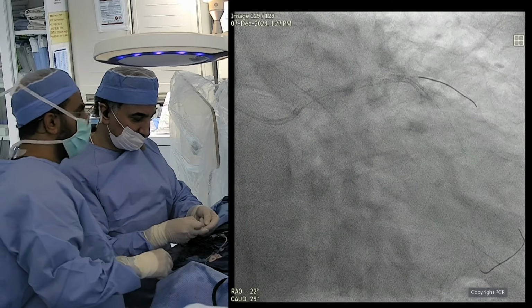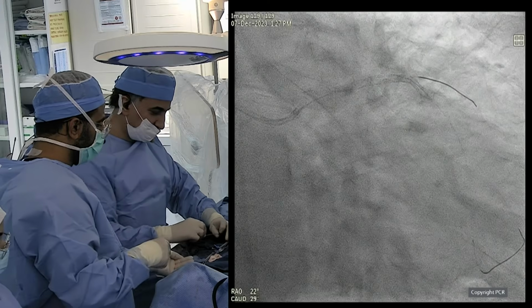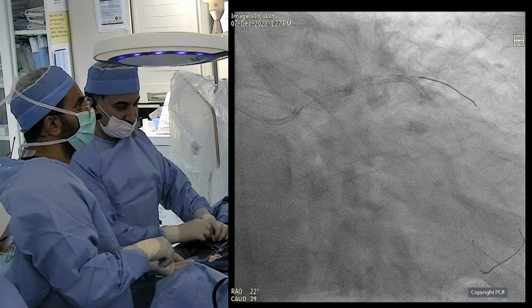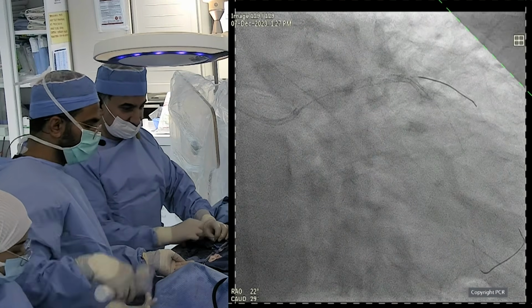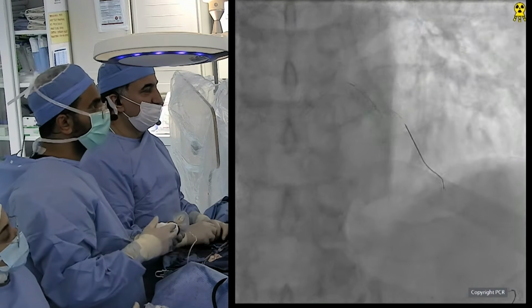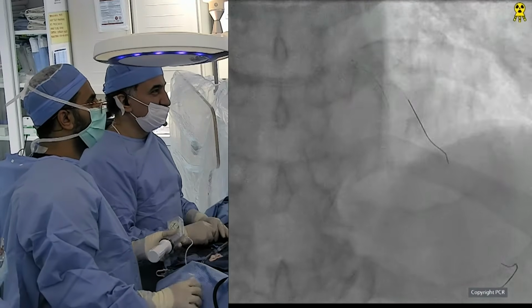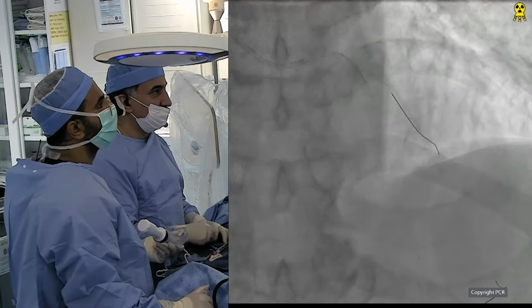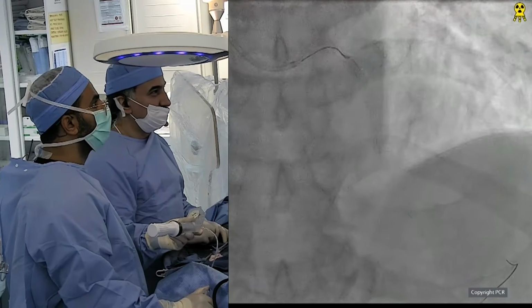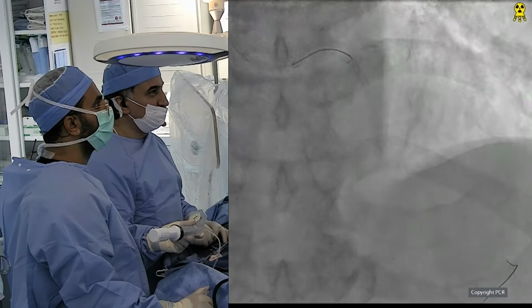And you have a cranial jailed wire. That's a question that frequently comes up in these complex scenarios. You have a jailed wire now. Would you remove and rewire before post-dilation, or do you say actually they never get trapped? And does that change with whatever wire you're using as the jailed wire? They do. Exactly. Hussein, you're post-dilating with high pressure. Right, okay, that answers the question. It was difficult to come out.